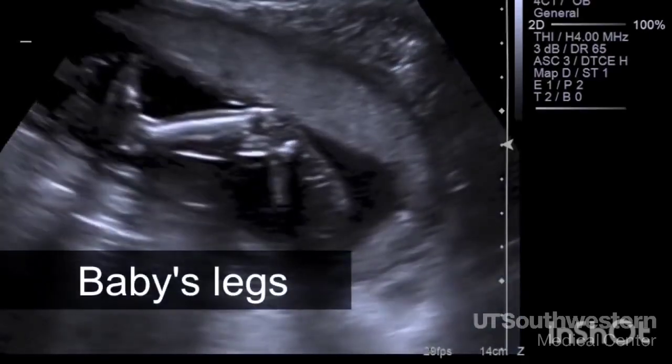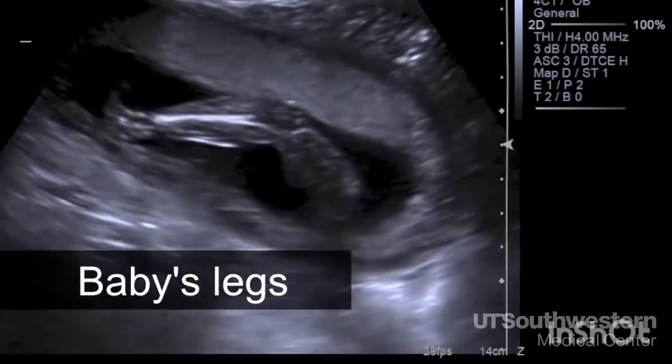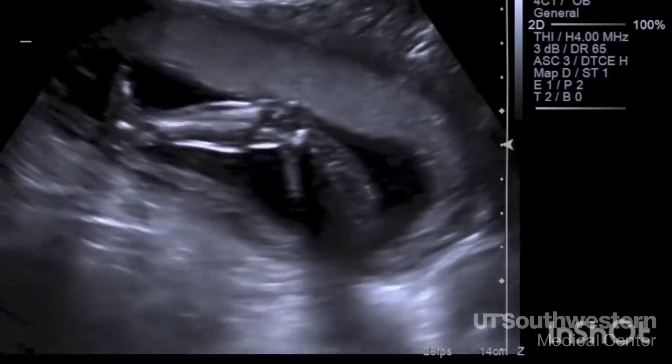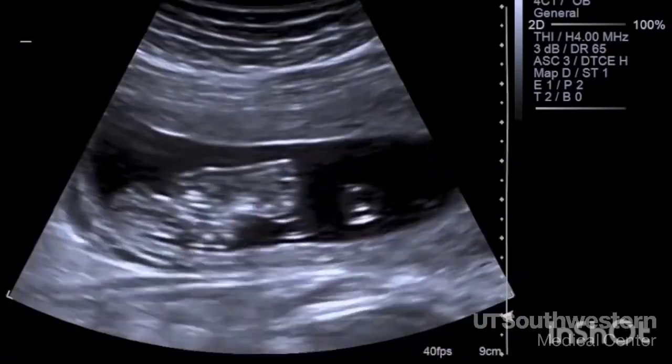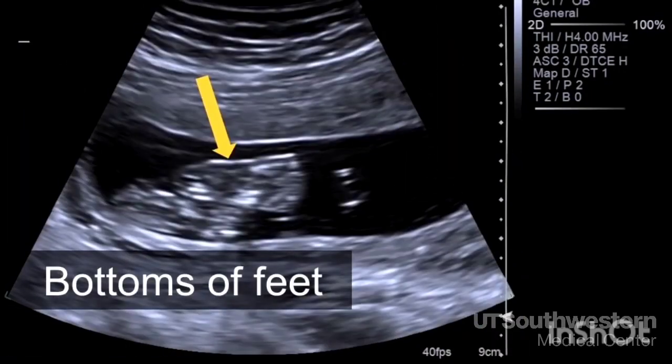Here are the baby's legs. They are extended and we see both of them moving. I also want to look at the position of the feet coming off at the ankles and make sure they're nice and straight with no evidence of a clubbed foot. That's where the foot is turned in or out. And finally, these are the bottoms of both feet, like footprints.